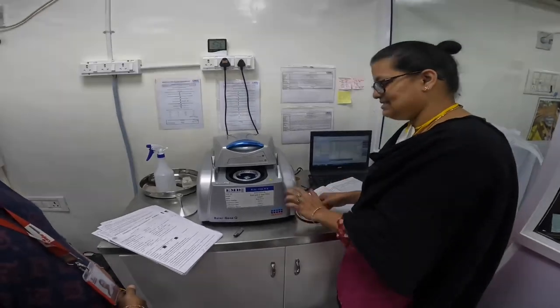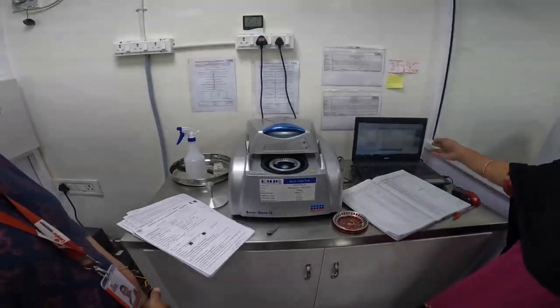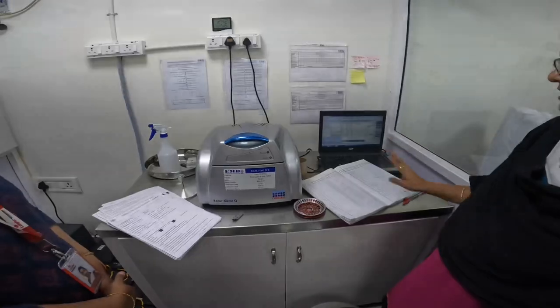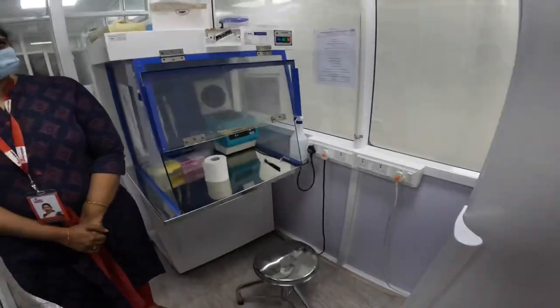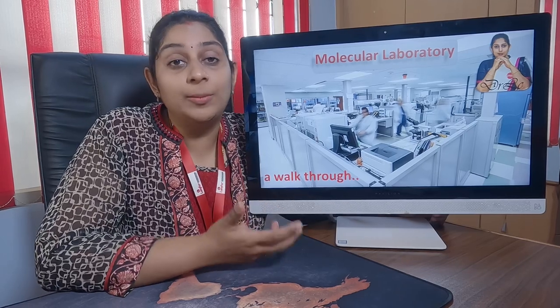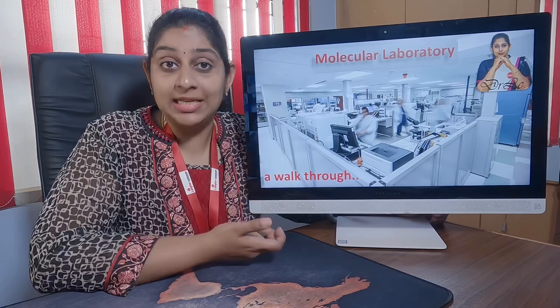For this whole workload, once a sample is received in the laboratory, it goes through room 1, room 2, room 3, and then this machine, generating a report. In total it usually takes around 4 hours. That is why when anybody gives a sample to a lab, they usually get the report in about 6 hours. I hope this video has given you a lot of insights into how a molecular laboratory is set up and how it works and functions on a daily basis.